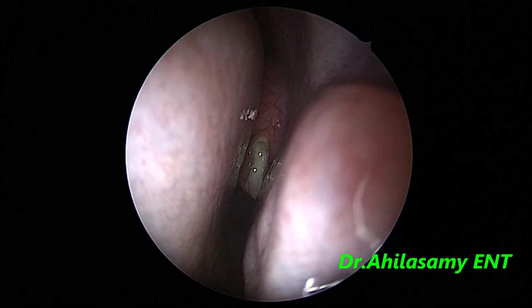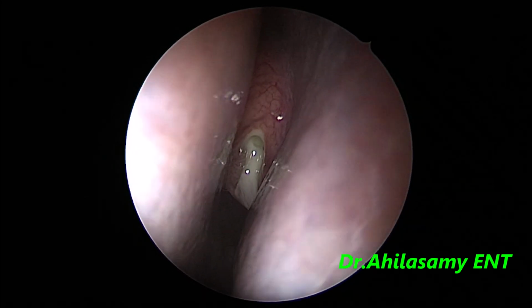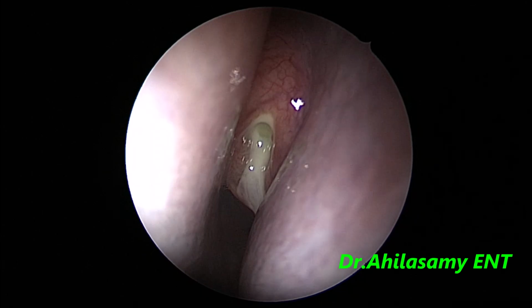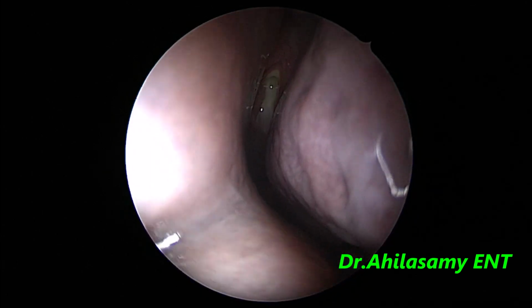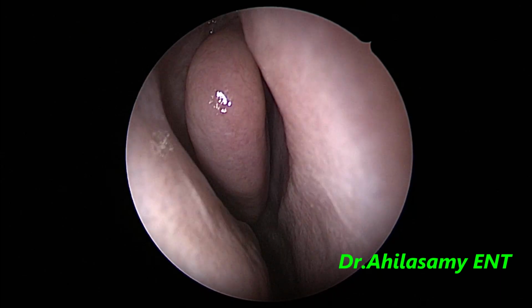This is a 40-year-old male patient. You can see a swollen uncinate looking like a middle turbinate, and there is pus dripping from that. This is a diagnostic endoscopy. The right side is normal and everything.